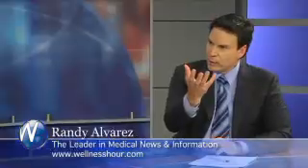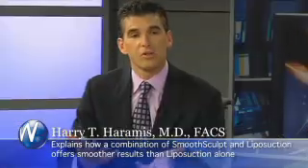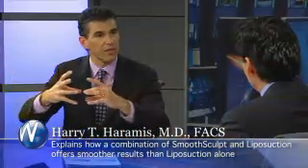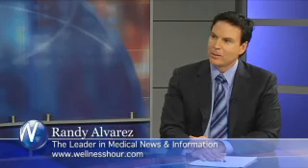So this ultrasound? Yes. Okay. That's what's helping? I mean, is it heating the area? So I understand a little bit how it works? There is a little heat. The high-frequency sound wave sends out sound waves that dissolve the fat, break it up. Also it stimulates, with the heat, the collagen underneath the skin to tighten. Okay. So it's also making the fat easier to come out, tightening the skin, getting a little lift. The area is smaller. It heals very nicely. So arms are a great area? Great area. Okay. What else?